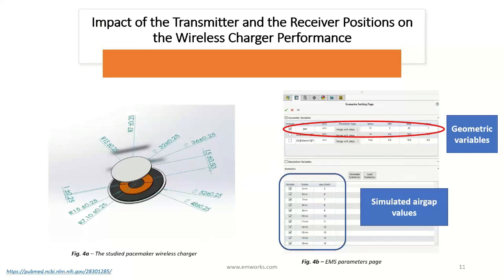Now we are going to see how the axial air gap can affect the different parameters of the studied wireless charger. The studied wireless charger is shown in figure 4a. It is made of two coils with the same dimensions. Each coil has 10 turns. In addition to coils, the system has on both sides aluminum and iron cores for shielding purposes. The initial air gap distance is 15 mm.